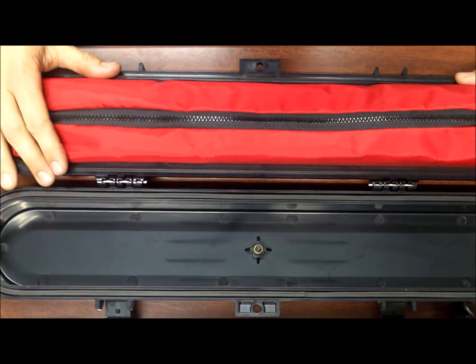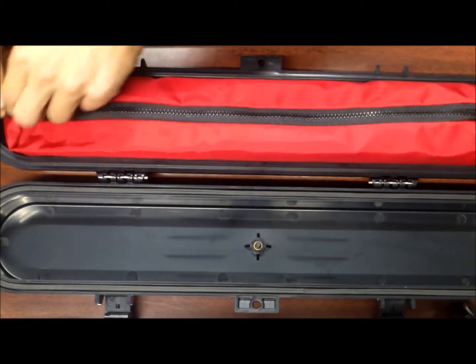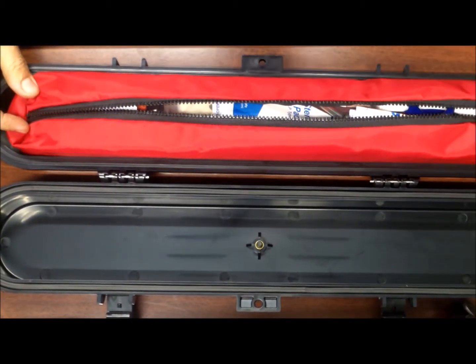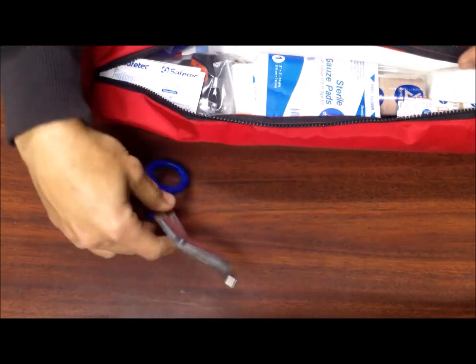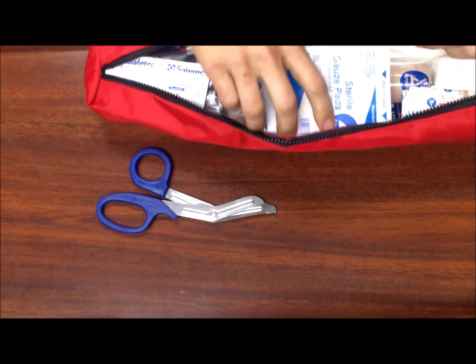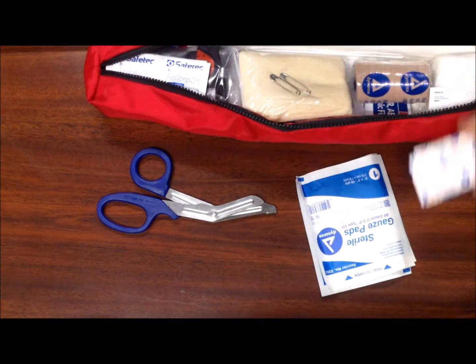This rip-stop nylon pouch is completely removable — it comes right out, and there is some room in here for you to add some other supplies if you want. We'll go ahead and set the case aside and go over what is in here. There is a set of trauma shears for cutting seat belts and clothing, sterile gauze pads, and bandages.